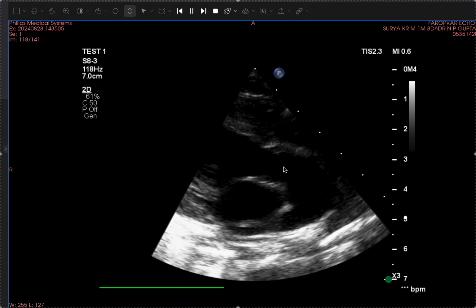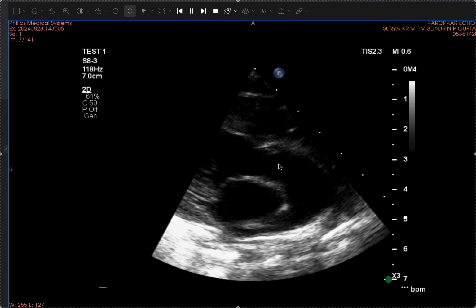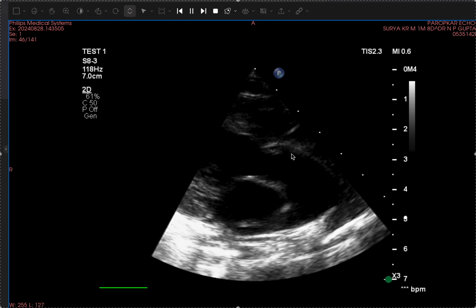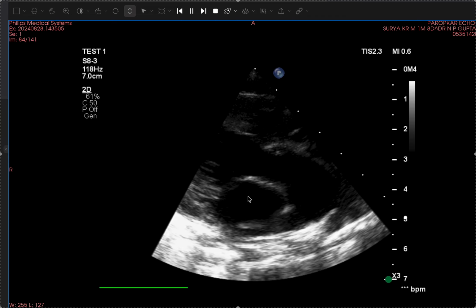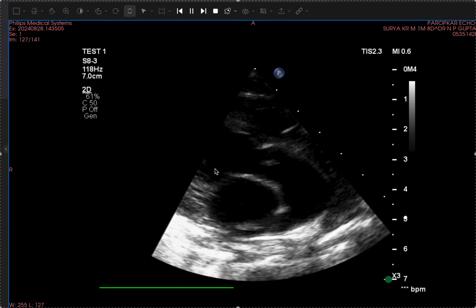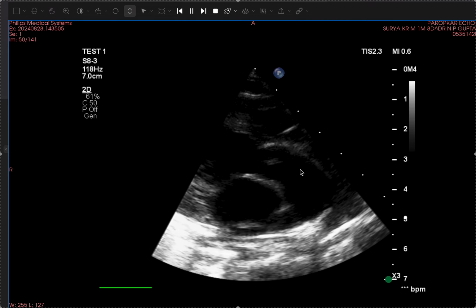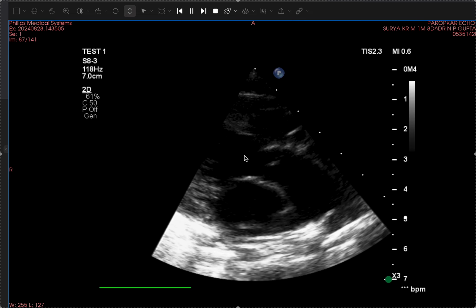So whenever you have to find out detransposition, try to see how aorta and pulmonary artery is in the beginning. So this is pulmonary artery, this is aorta. In the beginning both are parallel, so indicating transposition of great arteries. In this case, left atrium to left ventricle and right atrium to right ventricle, so AV concordance and VA discordance, atrioventricular concordance and ventriculo-arterial discordance. So this is case of detransposition along with tricuspid valve atresia. So this is parasternal long axis view.